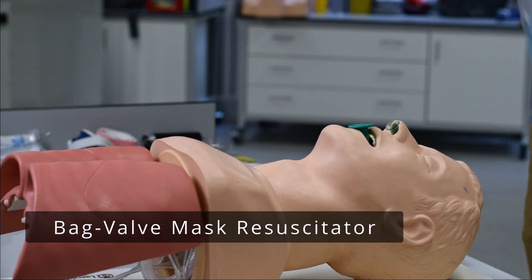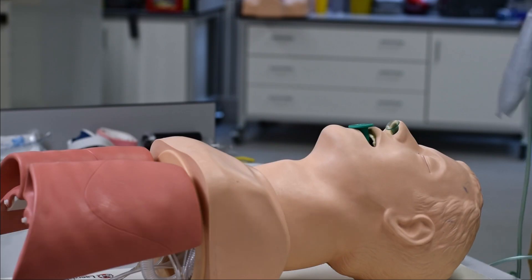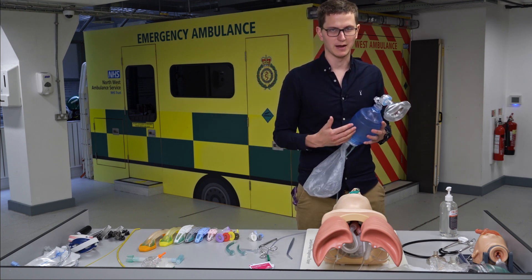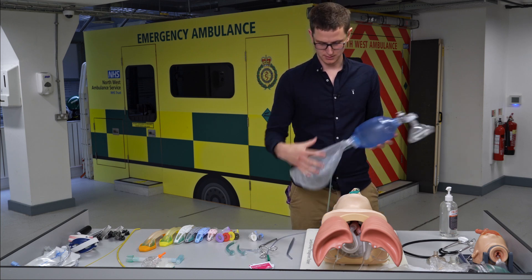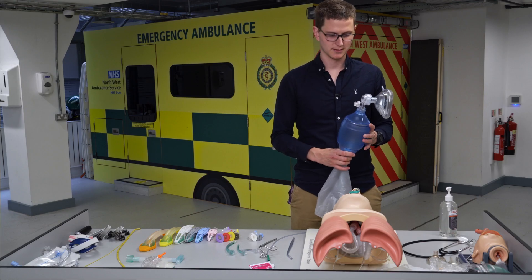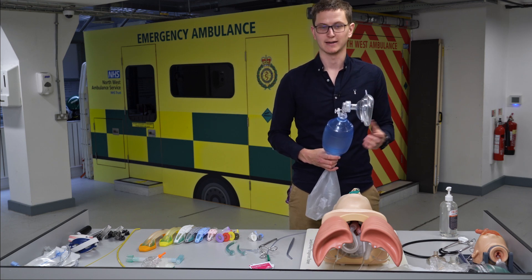Let's go to the BVM — bag valve mask, BVMR, or ambu bag. Different names in different places; go with what the manufacturer named it. The original was the ambu bag, but BVM or BVMR — bag valve mask reservoir — is common. How does this device work? When I squeeze it, air comes out. We use this to manually ventilate someone.